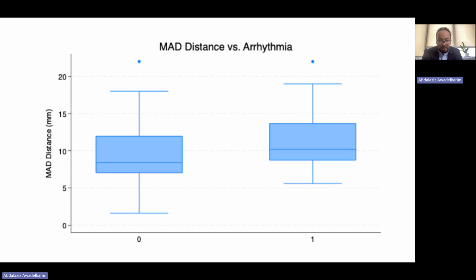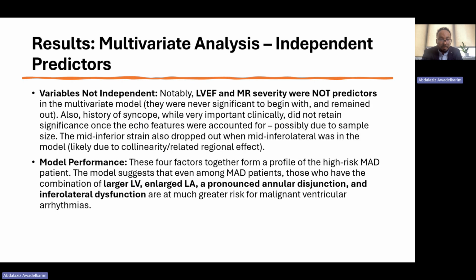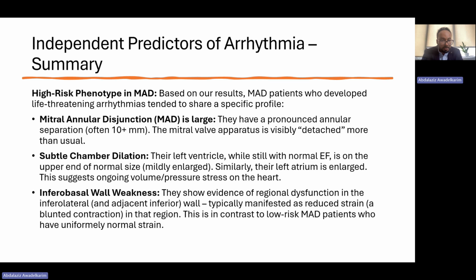Again, this is another illustration of the difference between the arrhythmia and the non-arrhythmia group. And again, EF, MR severity, and other conventional echocardiographic metrics did not differ between the two groups.